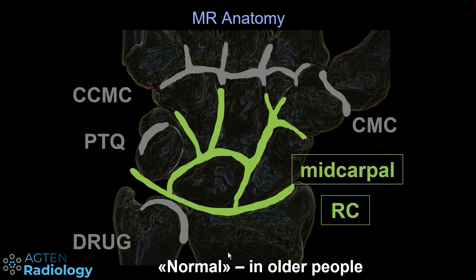Also considered to be normal is a communication between the radiocarpal joint and the midcarpal compartment. Especially during arthrography, if you inject the midcarpal compartment you can have contrast communication through small defects either through the SL or LT space — especially the thin membranous portion of these two ligaments can have holes and facilitate communication between these two compartments.